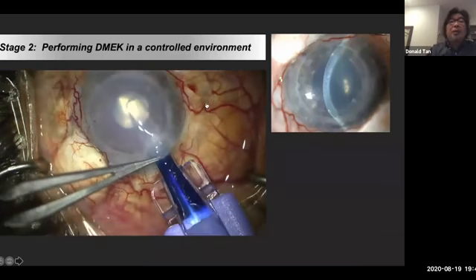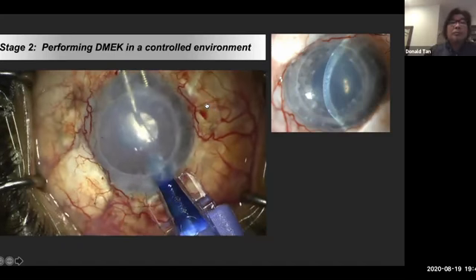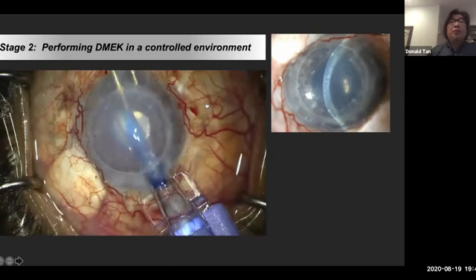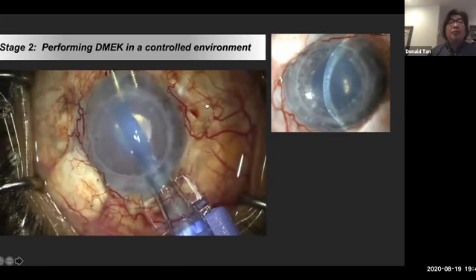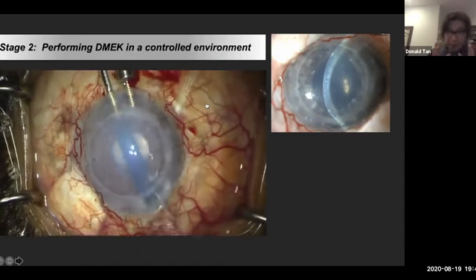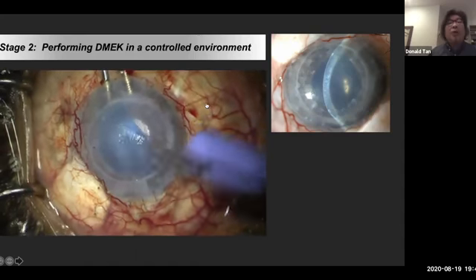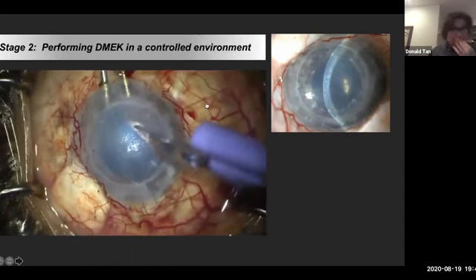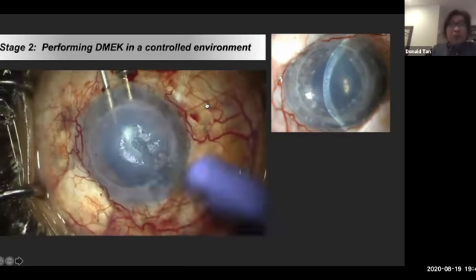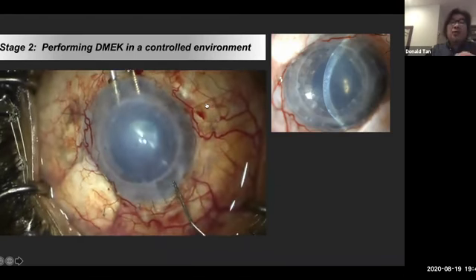So here's the DMEK. And doing a DMEK graft in a previous PK, a little bit more tricky. I will refine the DMEK graft to generally fit the PK so there's no overlap. And one has to be a little bit more accurate in centering the graft. There's obviously high dislocation rate, but you will appreciate that this is not that much different from a normal DMEK now because we have normalized the angles and the pupil is centered and a relatively small opening.